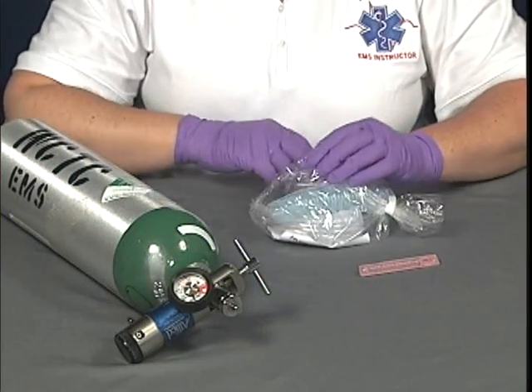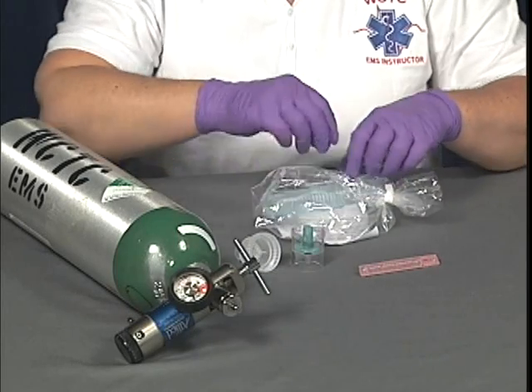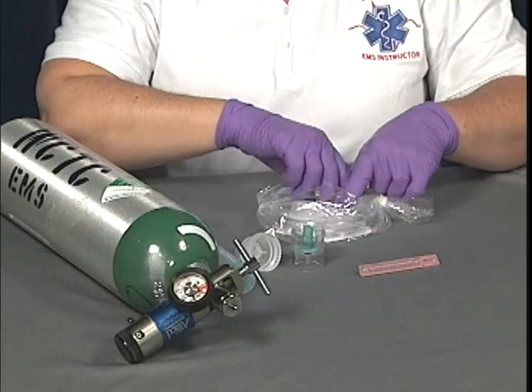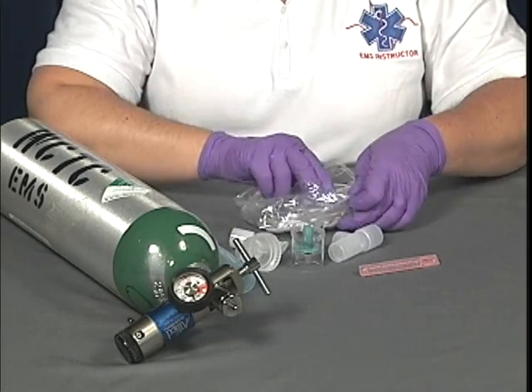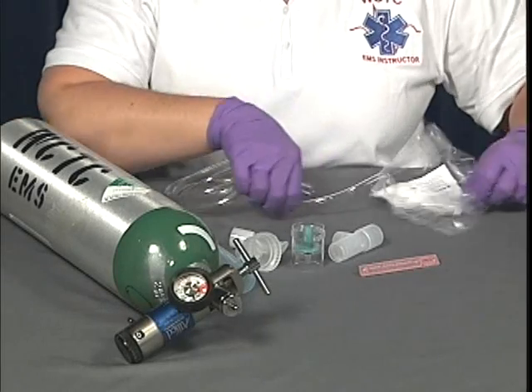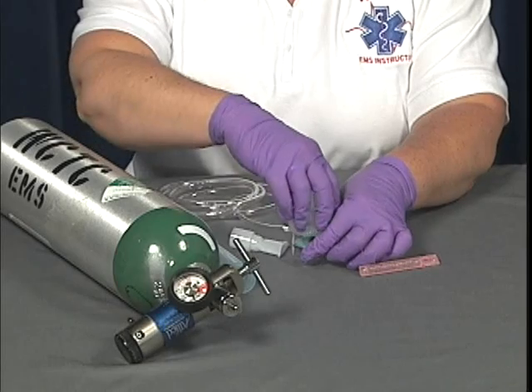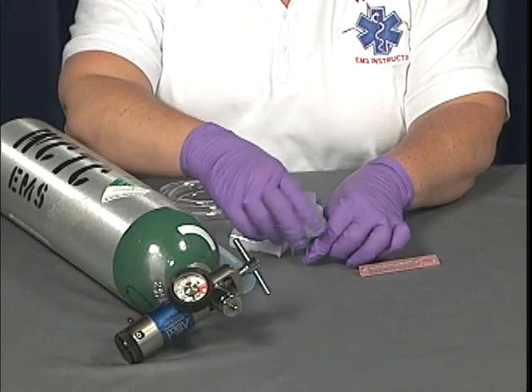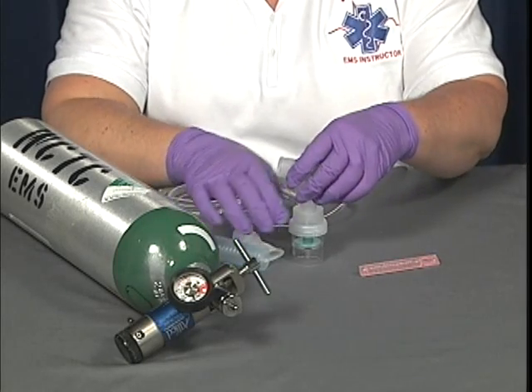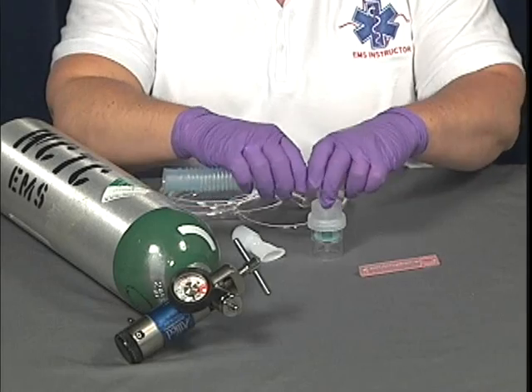Select the nebulizer delivery method based on the patient's ability to hold the device and coordinate inhalation and breathing technique. Here we are demonstrating using the T-fitting device. You can pre-assemble the medication cup by screwing the top and bottom sections together. Now, take the T-piece fitting, place it on top, and connect the corrugated tubing to one side and the mouthpiece to the other side.